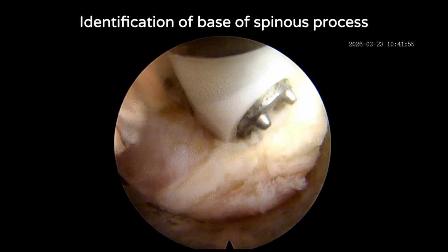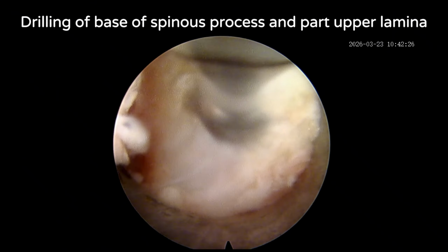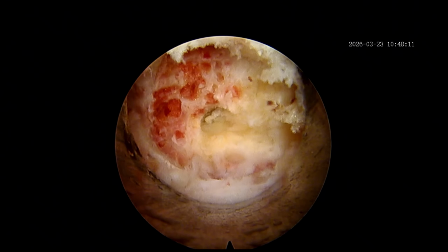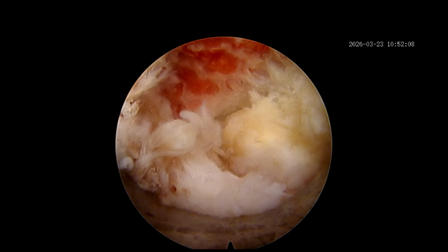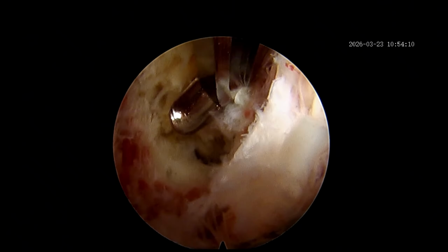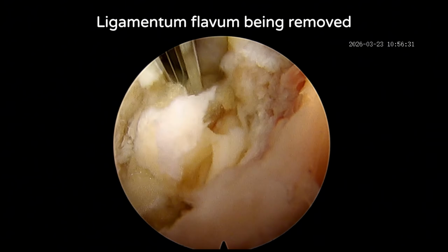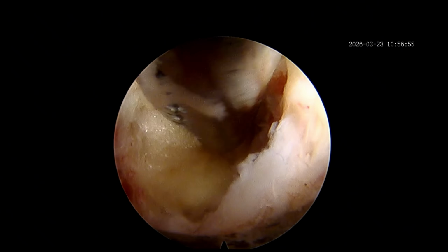Now as soon as you enter into the space, you will see the soft tissue. Clear the soft tissue, start with your drill, and in the pendular fashion slowly and slowly remove the upper lamina, keeping the ventral of the lamina intact. Then you can use your punch and slowly take the bites cranially. It is really very important to preserve the facets, as we are doing endoscopically, and the idea is to preserve the facet. So then you start your flavectomy.